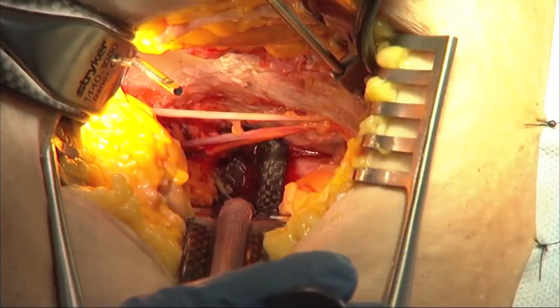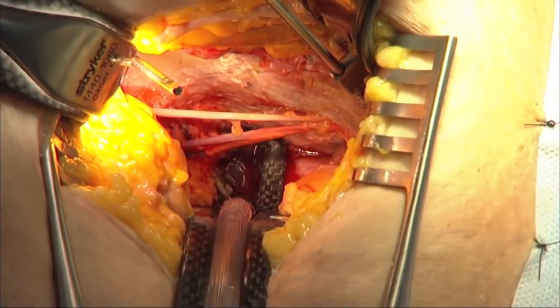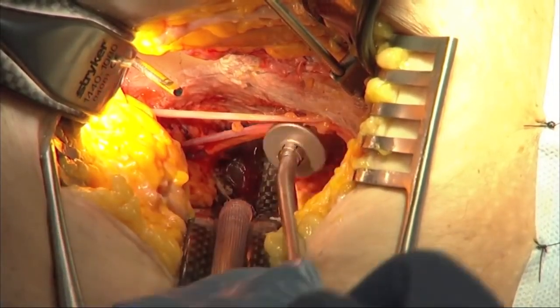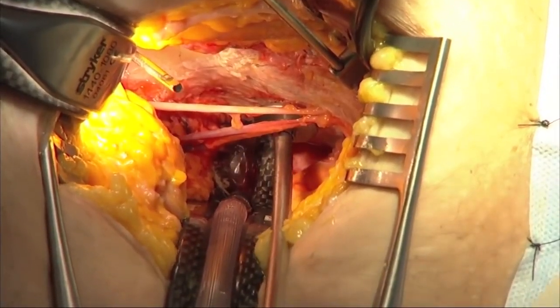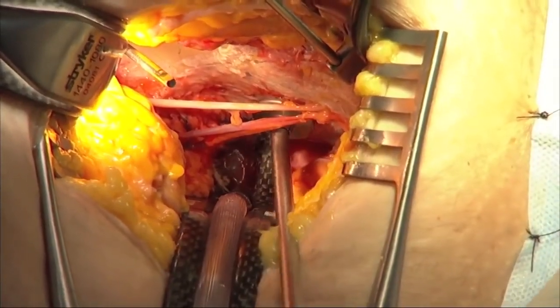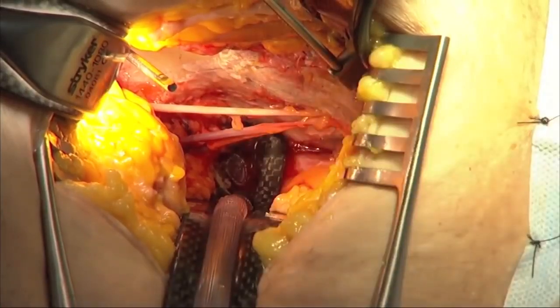So we use the spiked washer or the foot plate on the end of the picador so that we can increase the surface area for contact and better reduce the posterior column in the quadrilateral surface without having the risk of fracture. We can work either above or below the nerve to protect it.